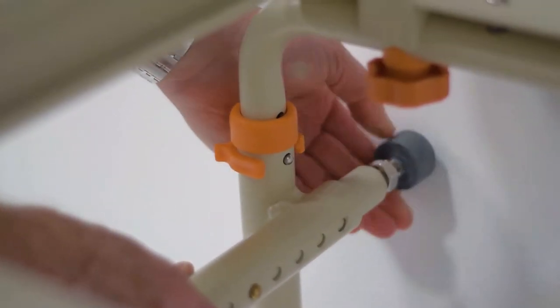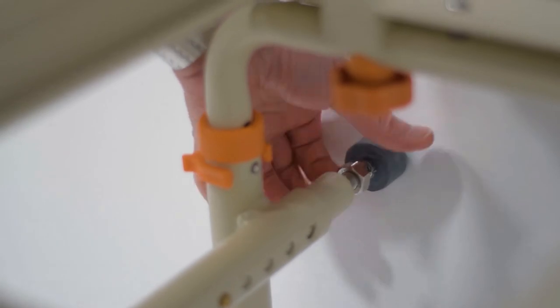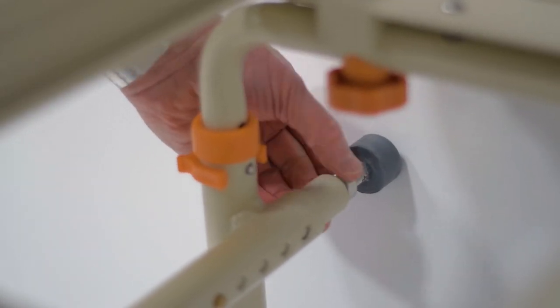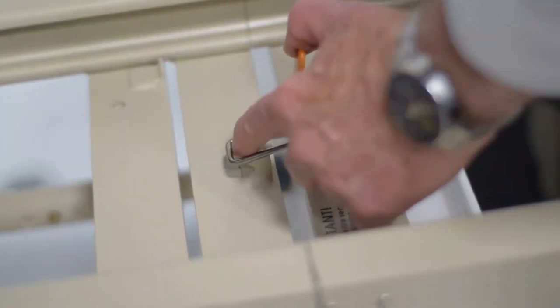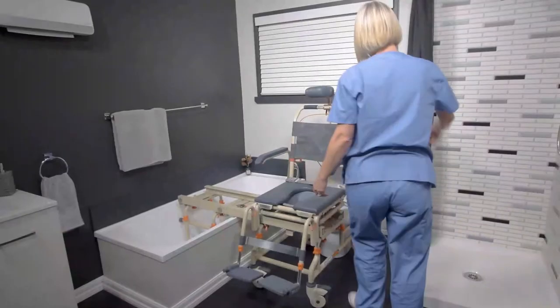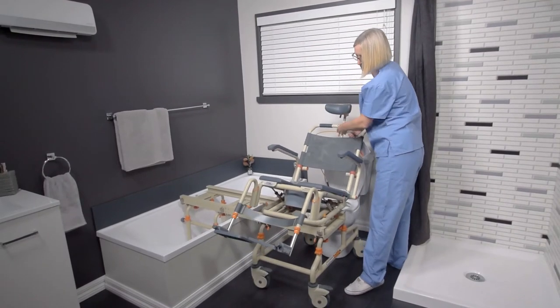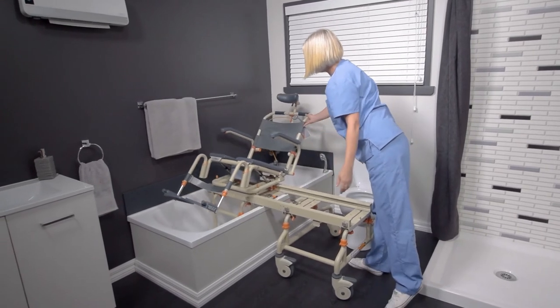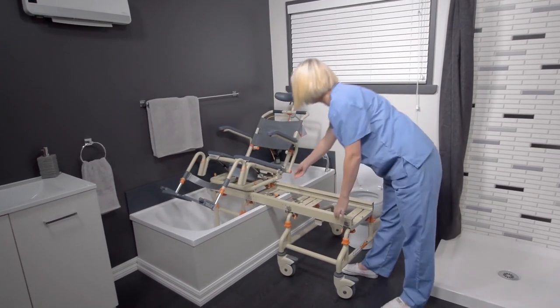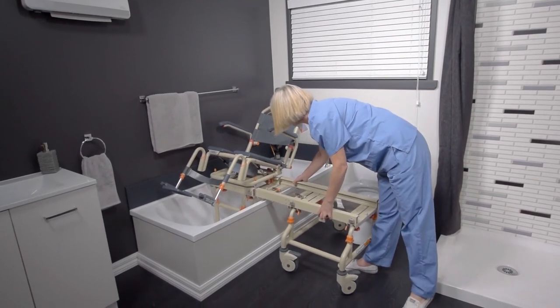After the bath base location and heights have been set, you can adjust the side stabilizers to push out against the bathtub, giving the most secure transfer possible for your user. Latch the units then tilt, release the brake in the direction of travel and transfer your user. Now you can unlatch and remove the bridge and rolling base of the chair to allow your user to enjoy a private shower.